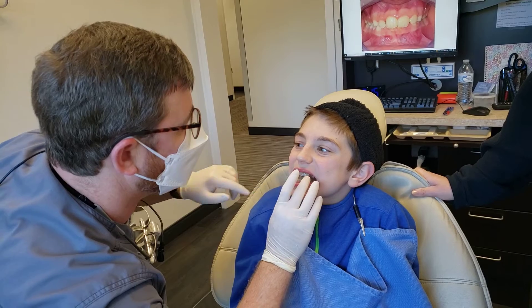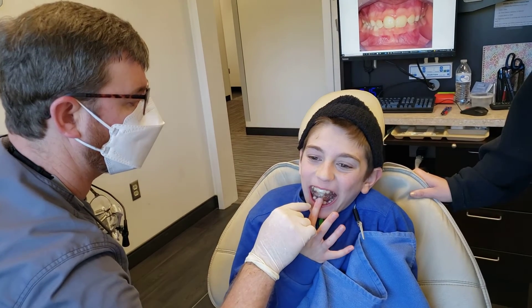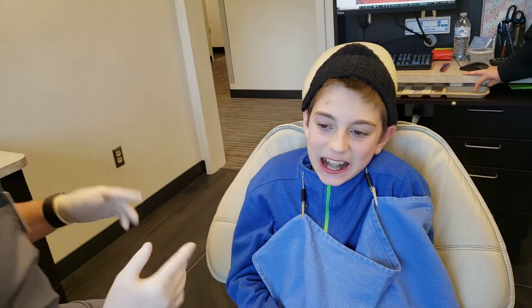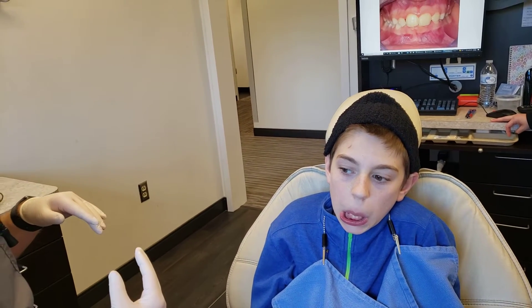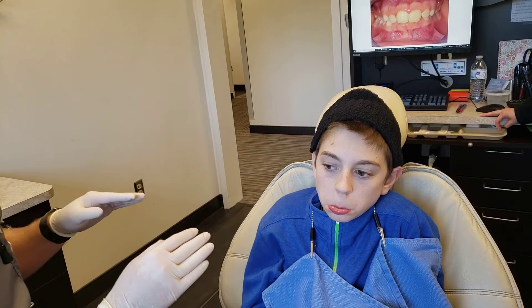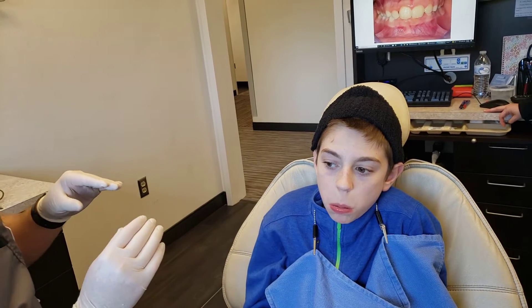When you squeeze a little bit harder, where do you feel it hurting? Here and here. So what it's doing is trying to push those two teeth, which is what we want, but if you push too hard it's going to be uncomfortable. This is the time when he's lost several baby teeth and the permanent ones are coming in.